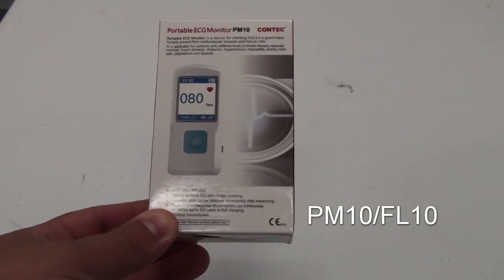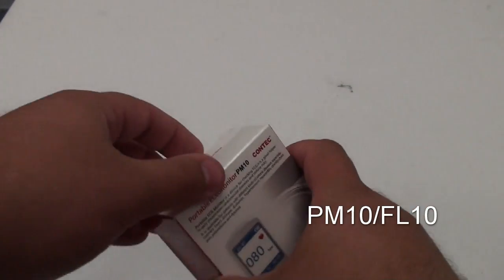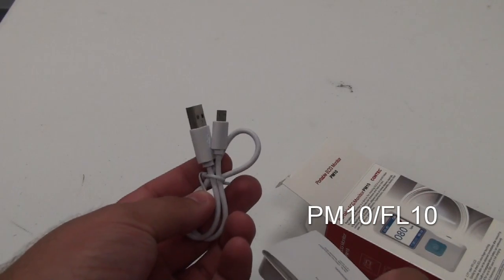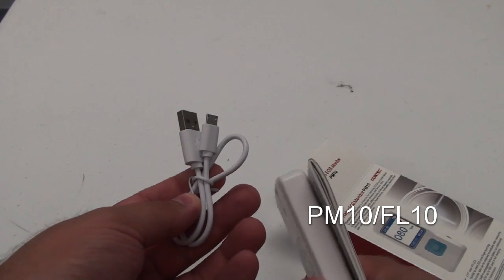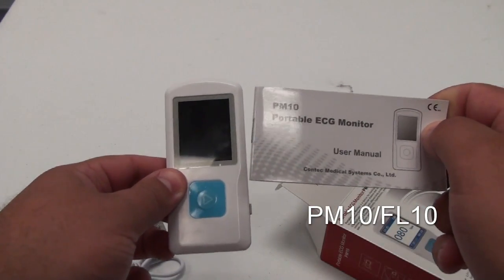Hello and welcome to the unboxing of the PM10FL10. In each box, you'll receive the USB cable if you'd like to transfer the data via your computer. This device is also Bluetooth. You'll also receive the device itself and the instruction manual.